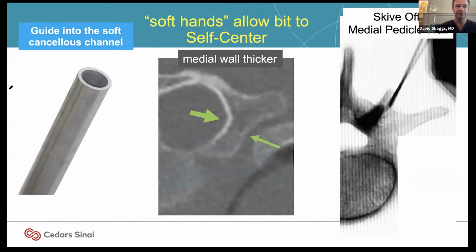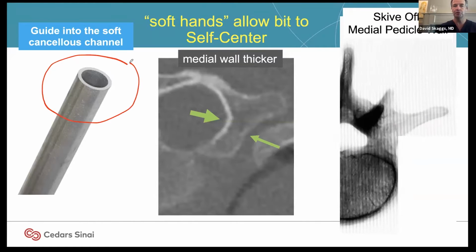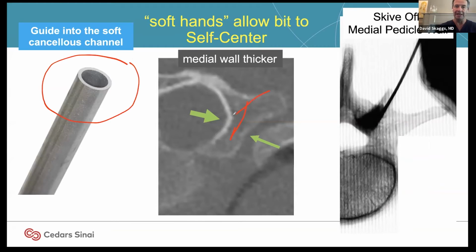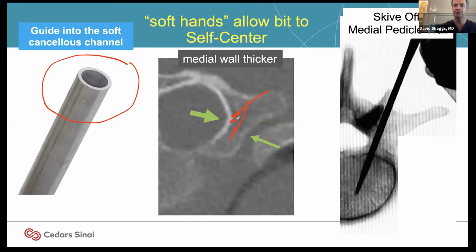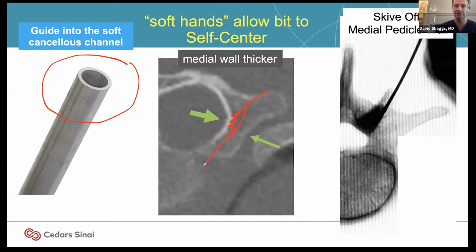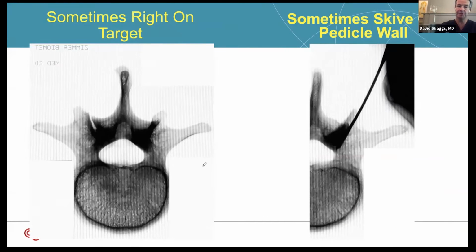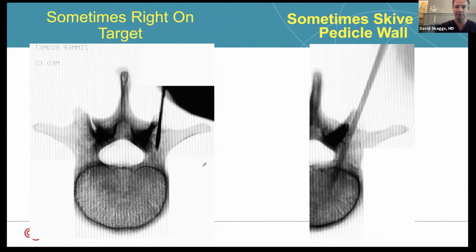Now, when we're putting in pedicle screws, we could imagine that the pedicle is almost like a pipe. It has hard cortical bone around the outside of it and then soft bone on the inside of it. So one could imagine that this flexible drill bit might hit the hard bone protecting the spinal cord. You just feel it. And as long as you are spinning the drill bit slowly, you feel this chatter, and then you feel it go into the soft bone. As long as you're not fighting against it, it will self-center into the soft bone. Sometimes it goes right in first time, and other times it doesn't. You have to fish around a little bit, as long as you're not pushing too hard and you're allowing the soft bone to be found.